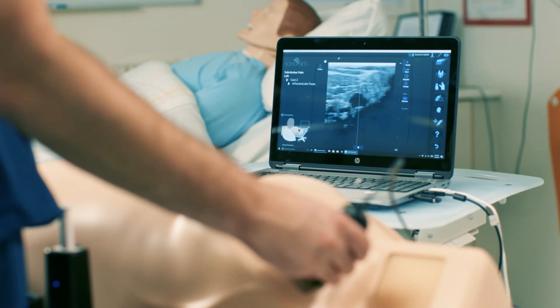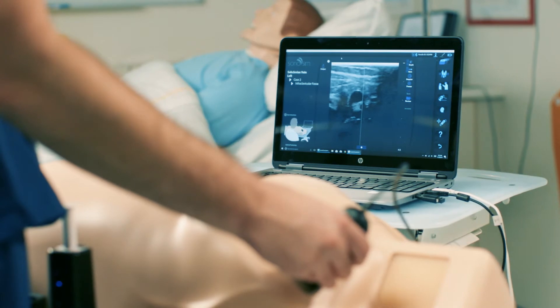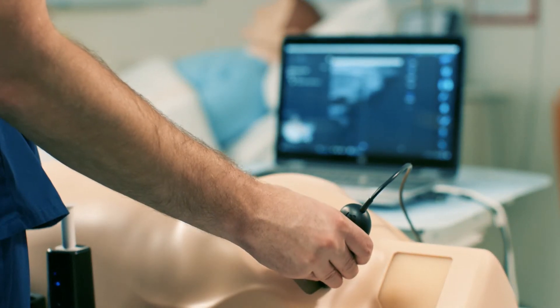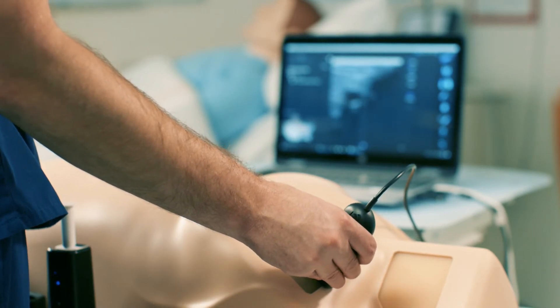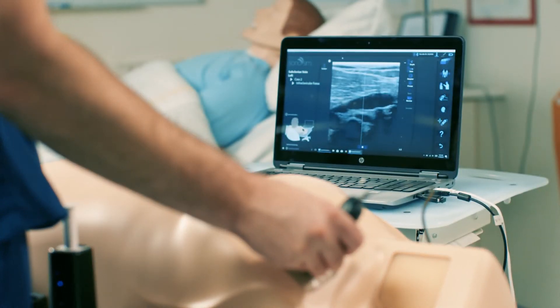Patient cases are real patient-based ultrasound cases highlighting internal jugular, femoral, and subclavian vein ultrasound-guided procedures. Users can practice their skills learned from the Skillbox in real situations on a variety of different anatomy.